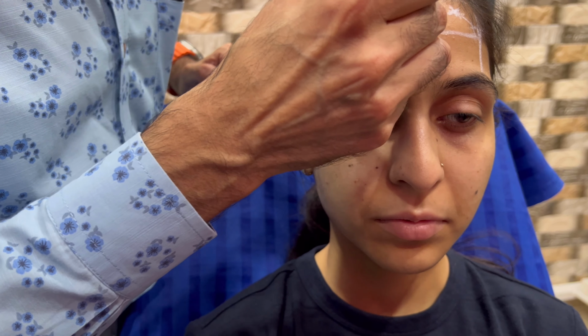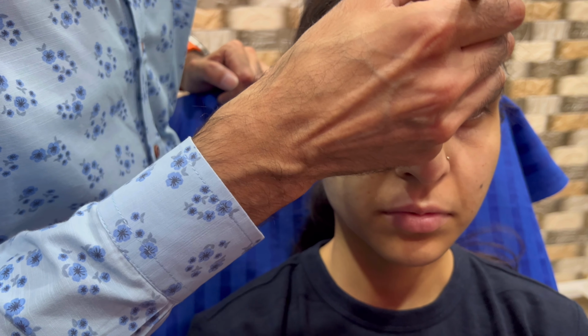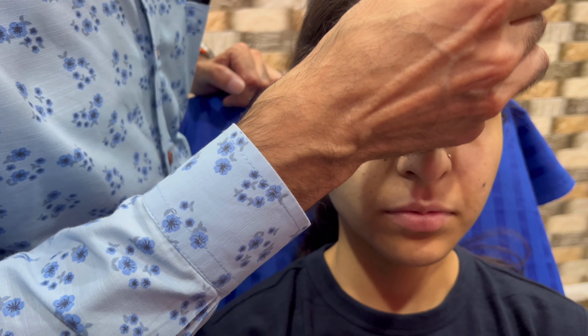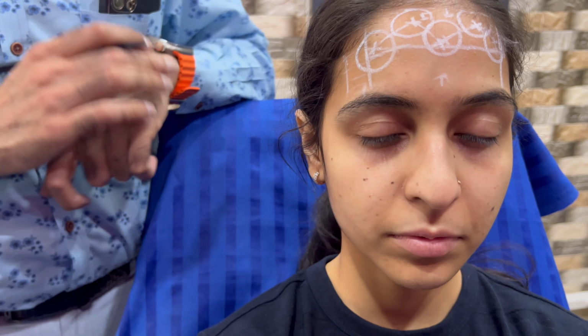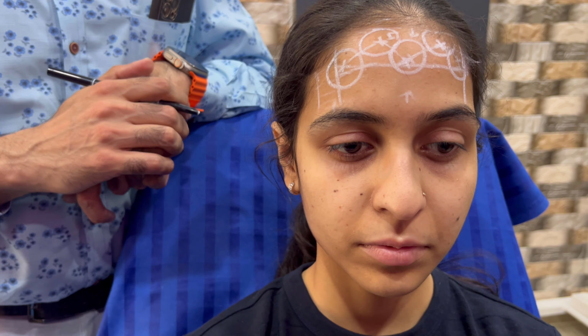So you're trying to create Olympic rings like this, so that the rings can coalesce with each other and give you a desired result. So this is how the toxin is going to act and give you a desired result. It's going to work with diffusion. So your dose is higher. You're putting 4 units per point.